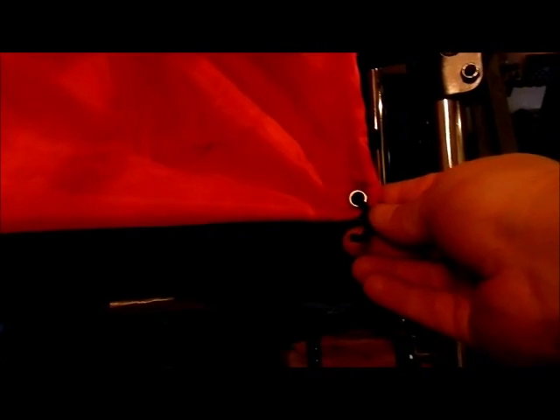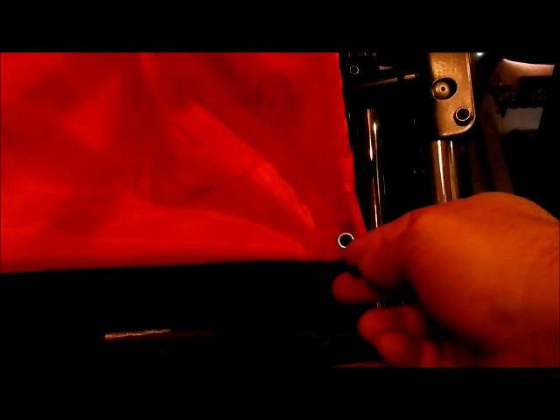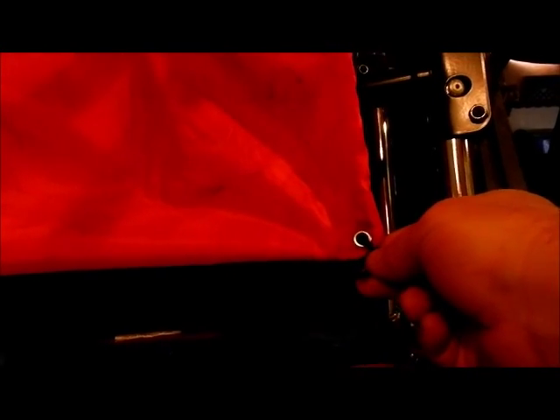There it is, a done deal. Trimmed off on the end. One way to stop nylon string from fraying is, as soon as you cut it, you heat the tips and you melt the nylon together and it won't fray. Just an idea for you. Okay, I left enough room there so if I had to tie it again, I can do that.